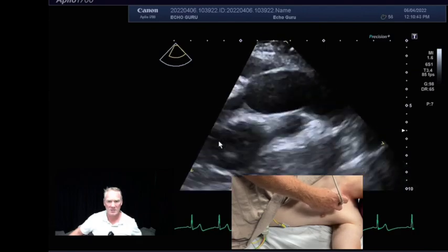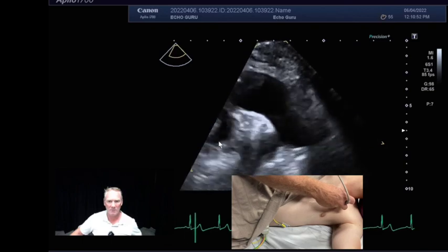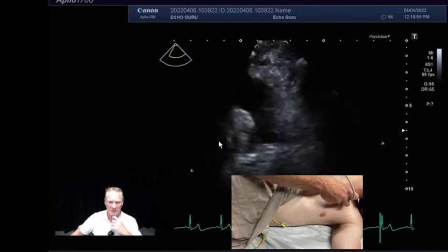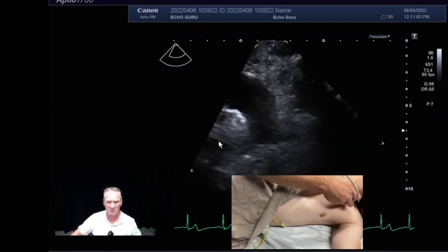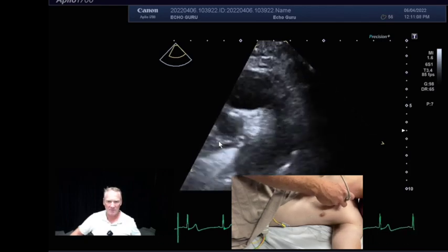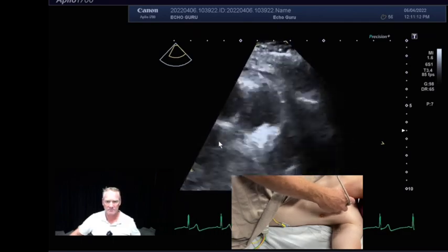Now you can see from the chest wall images, I'm really not going a long way, probably because it starts off so high, and then you're governed by what's up in the... aorta can't go too high up through there because of the suprasternal notch, and it's got to stay below the clavicle, obviously. So as I track along through there, we can see the descending aorta.